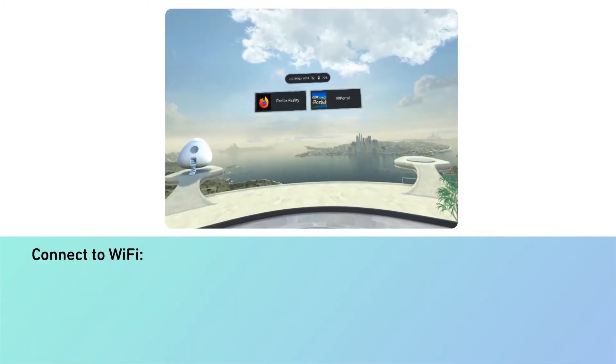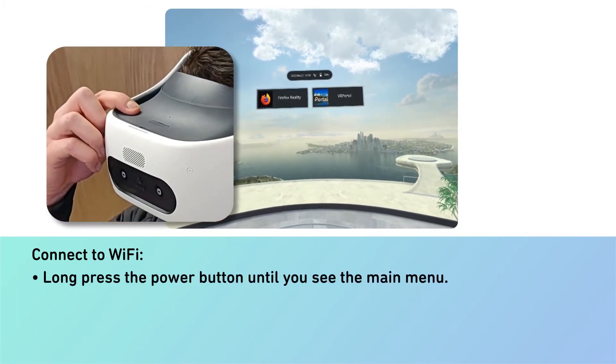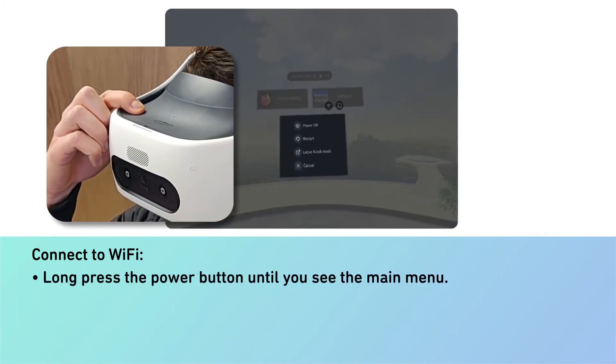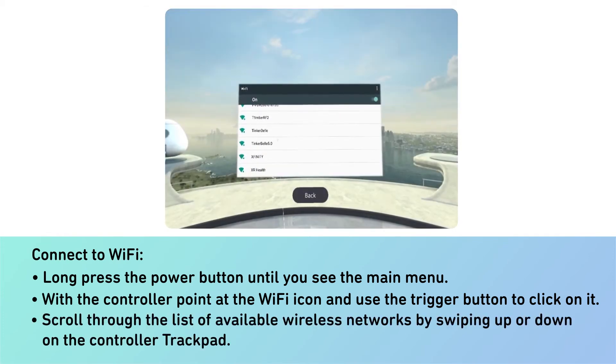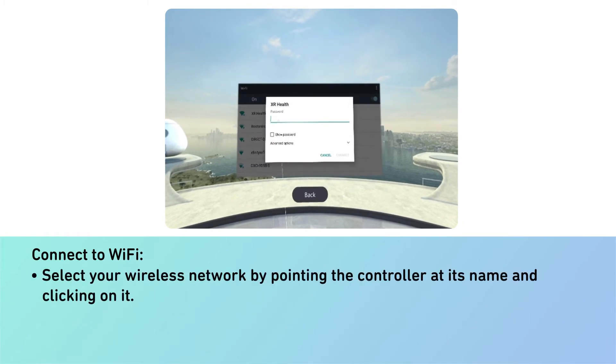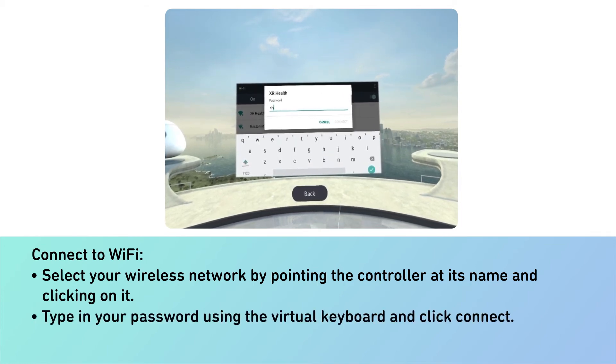Connect to Wi-Fi. Long press the power button until you see the main menu. With the controller, point at the Wi-Fi icon and use the trigger button to click on it. Scroll through the list of available wireless networks by swiping up or down on the controller track pad. Select your wireless network by pointing the controller at its name and clicking on it. Type in your password using the virtual keyboard and click connect.